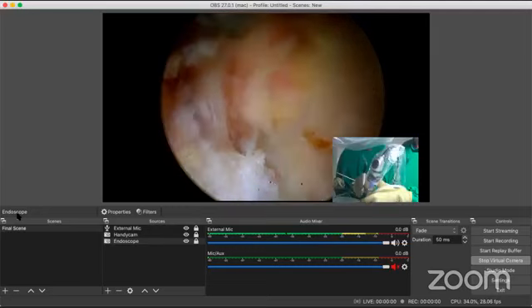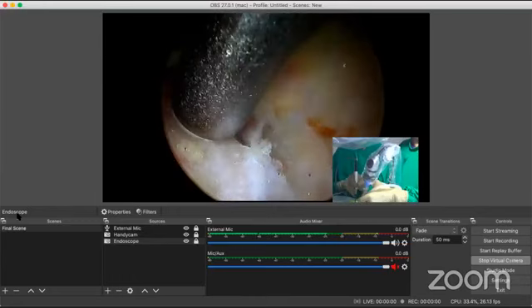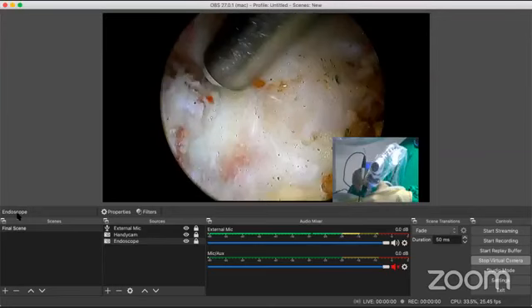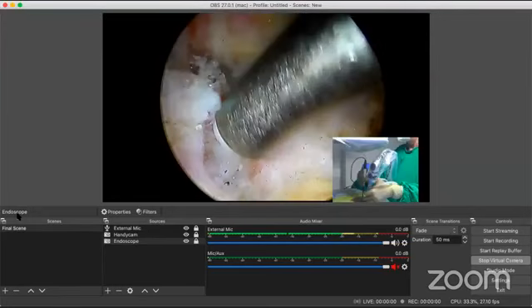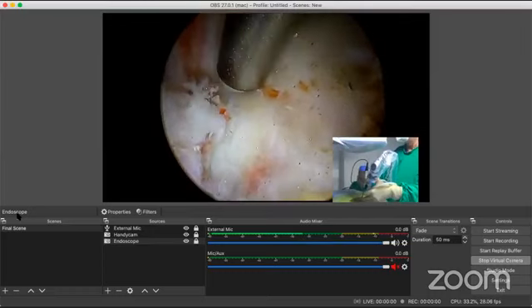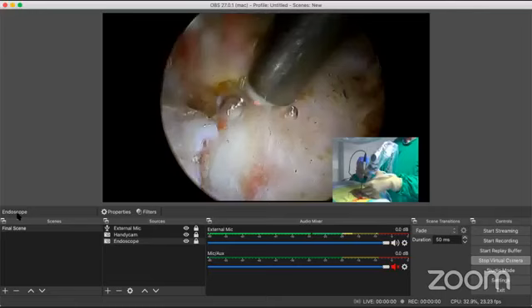because it gives me proper control of where I want to put a spot on. See, this is where we have burred. This is where joined the V here. This is the lamina. This was the original V. This is where the spinous process came. Touch. Blue, please. This was the original spot where the V is.